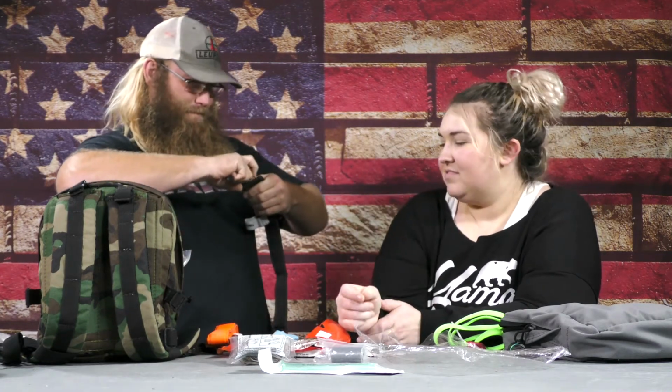I like these ones. The ones I had issued were my practice ones, and they break, they're not as good. The old ones, like the 2010 era. Yep. This one I like, but yeah, I like the Recons the most. The metal windlass is real nice. And honestly, it's just the construction of the metal windlass and the buckle that I really like. The buckle is huge too, because if you have the older, like the 2010 era ones, they pull apart real easy.